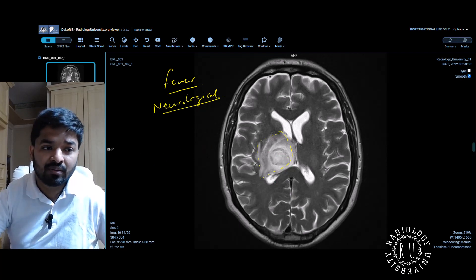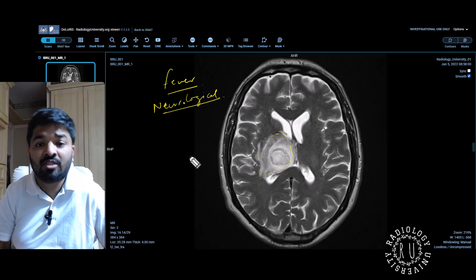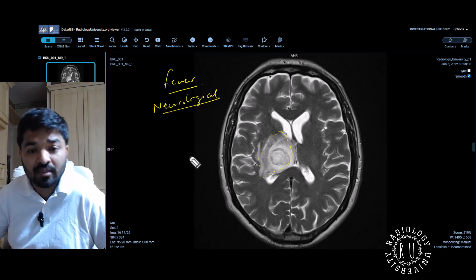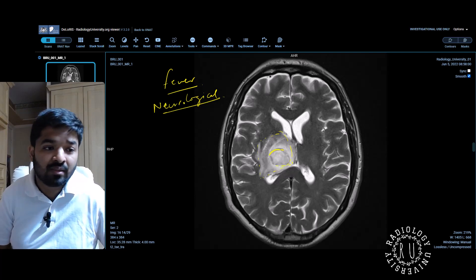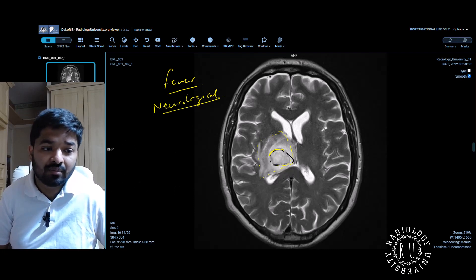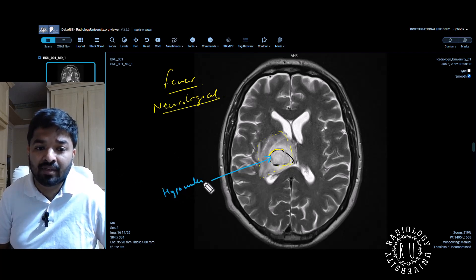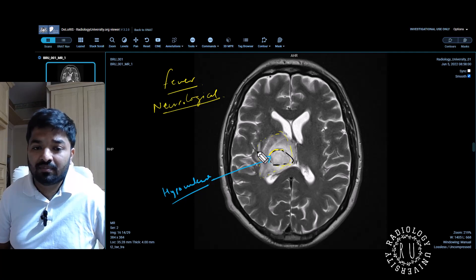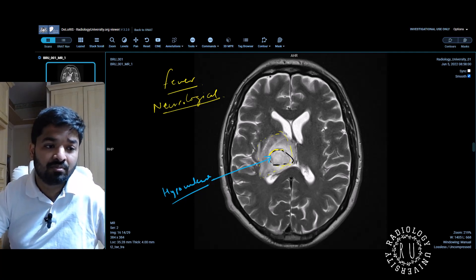Once you have done that, you will come back to signal intensity. This lesion is predominantly T2 hyperintense. However, there are some hypointense areas within it, and you will want to characterize it better — why it is hypointense inside.